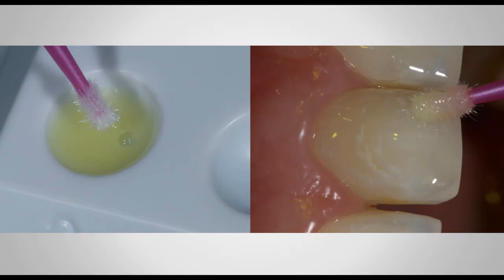Even though it's only spot etched, and that's what holds the bonded prototype in place, you still have some bonding of this composite to the actual enamel through this adhesive without any etching. You're going to have some bonding, some sealing of your prototype, and that way you're going to avoid small fractures or even staining of the margins, just in case the patient couldn't come back in a couple of weeks and you have to wait a little bit longer. So you don't want it to stain, you want it to maintain shininess and a high luster surface.